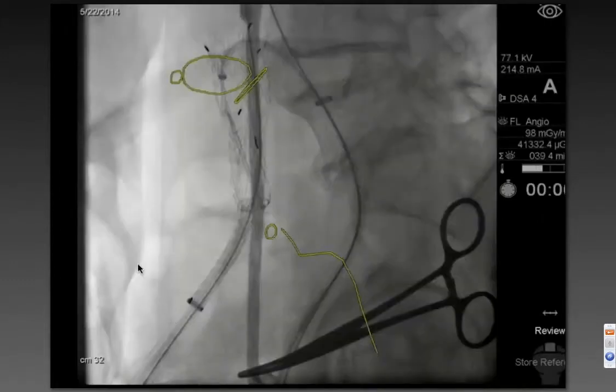And you can see that at this point in time, we're over the bifurcation. We're going to catheterize the origin of the internal iliac.